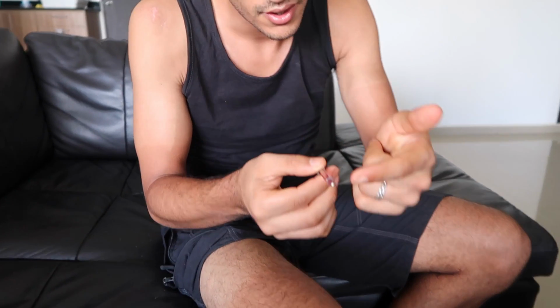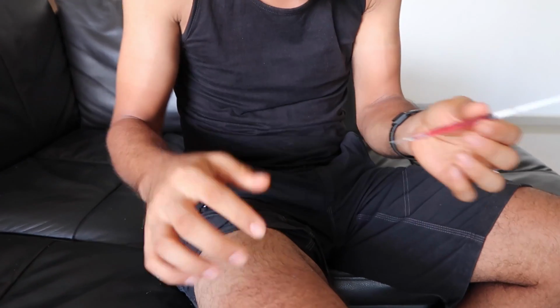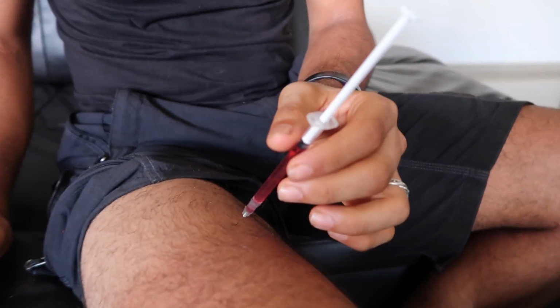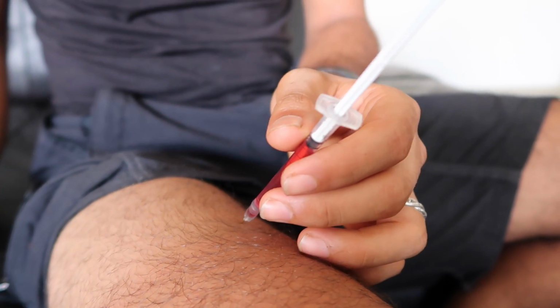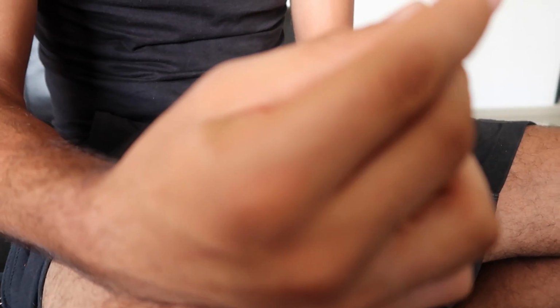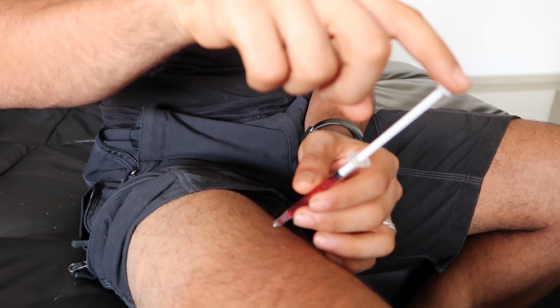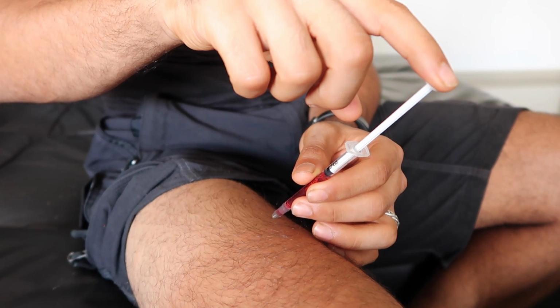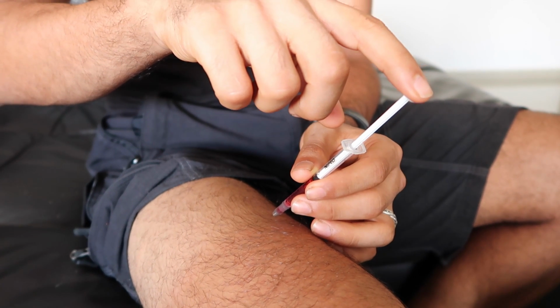And then as you can see, the needle's very small. All you're going to do is just gently get it through here, apply it to your skin, press it in, nice and gently. Make sure to try and relax while it breaks through. There you go. And then proceed by gently squeezing this, I'll kind of build a little momentum. It will go on its own, but it's very painless.